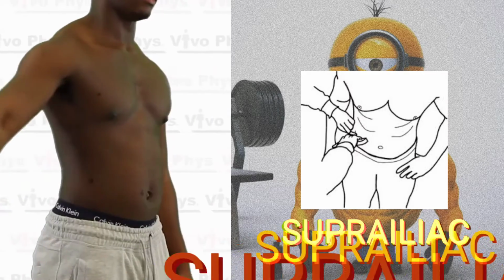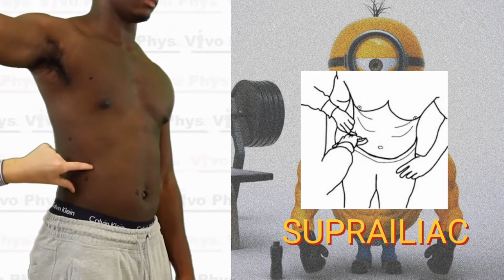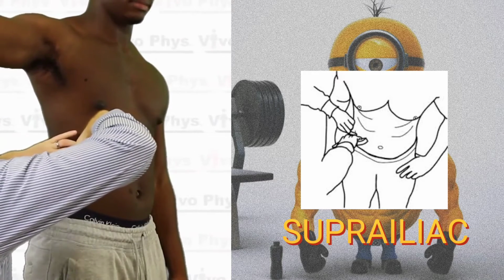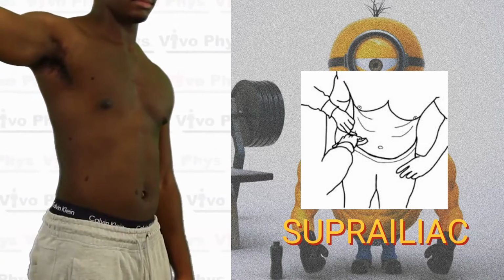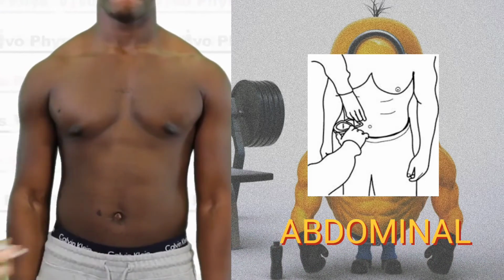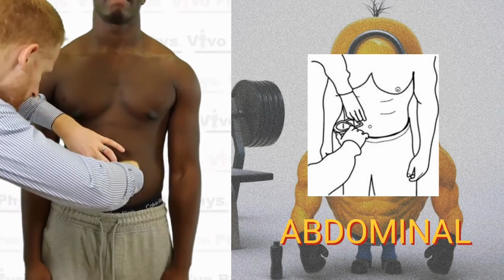A lot of people you're going to see do this far too close to the front of the individual. It's right where the front of the person and the side of the person meet where the skinfold location is going to be. Again, it's about an inch or so off of the iliac crest in line with the front of the armpit, and this is going to be a diagonal fold. The abdominal skinfold site is going to be about 1 inch or about 2 centimeters to the right of the belly button, and this is going to be a vertical fold.